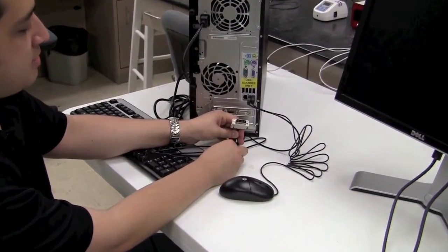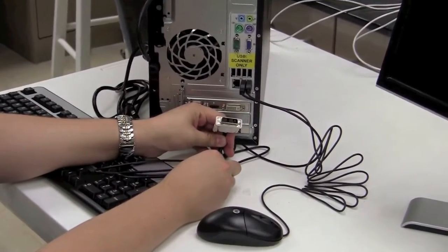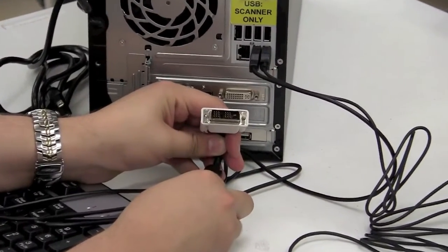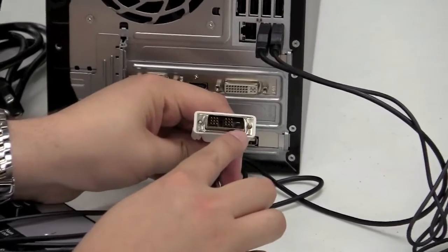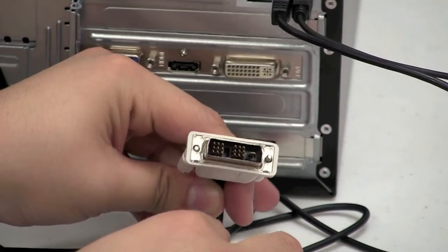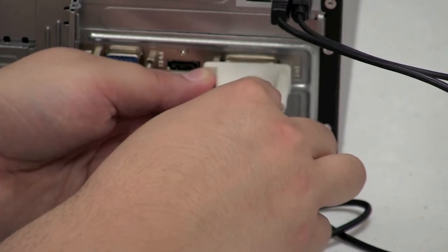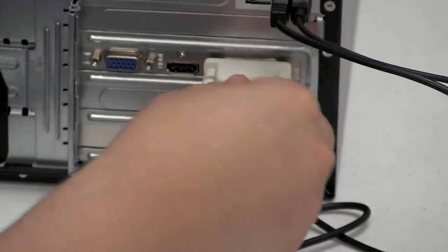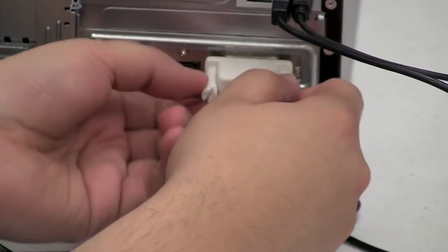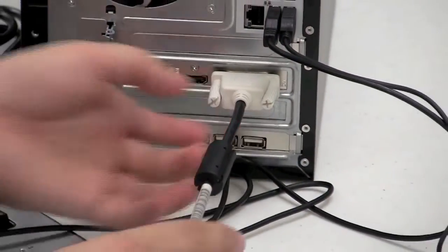Now that the monitor is set up to the base, plug the DVI video cable coming out of the monitor into the back of the computer tower. On the DVI cable there's a small flat prong — line it up with the female socket on the back of the computer tower and plug it straight in. Once in, fasten the two screws on each side to retain the cable. Hand tight should be good enough.